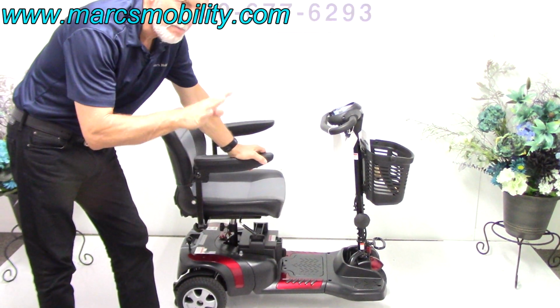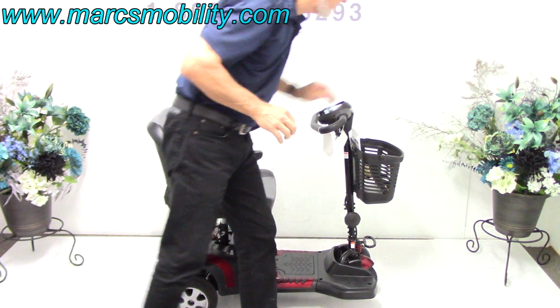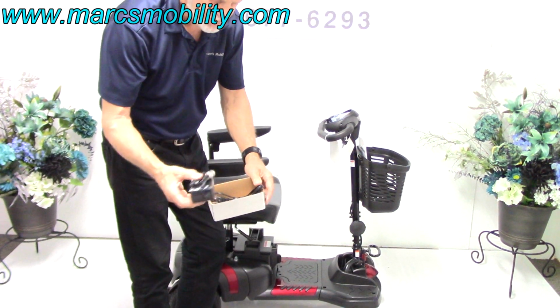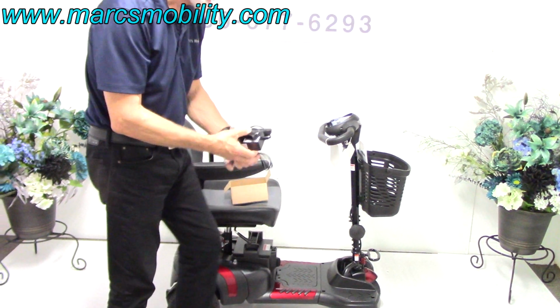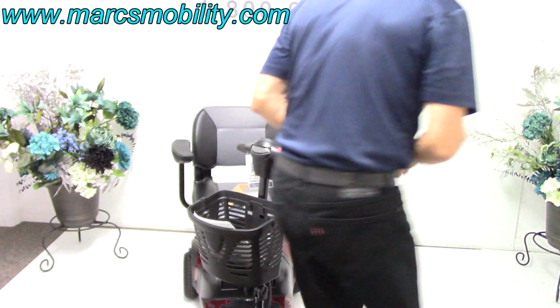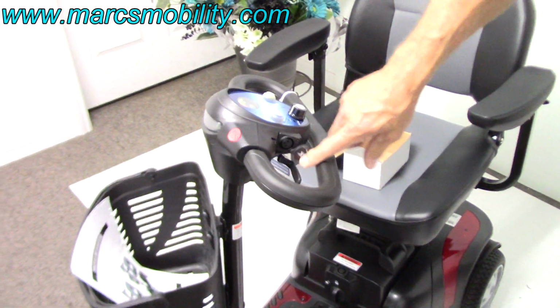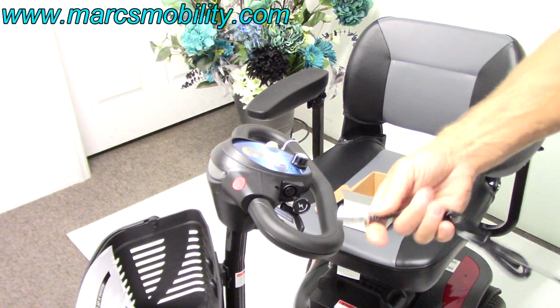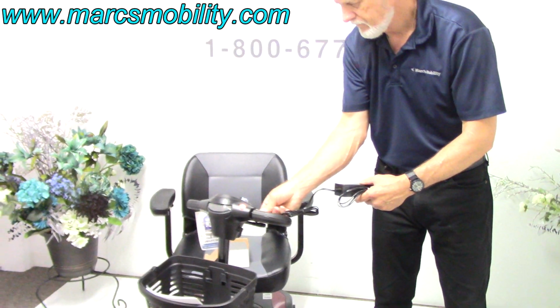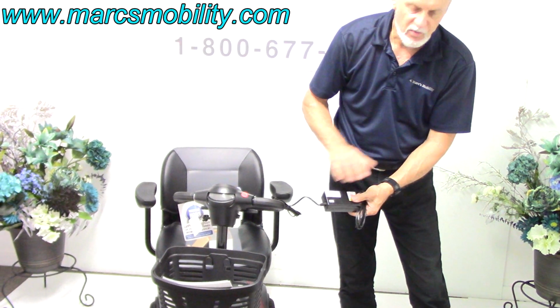This scooter will go about 4 miles an hour. The top speed is 4 miles an hour. When you charge this scooter, take your small charger. It is a small charger. As a matter of fact, you can carry this charger with you. Take your charger, and it plugs right here in the front. On the side of the scooter right there, you can see the plug. I'm going to open it up here. You plug your charger right here. And then you can see it's green. Plug it into the wall. When the light goes from red to green, you're fully charged.